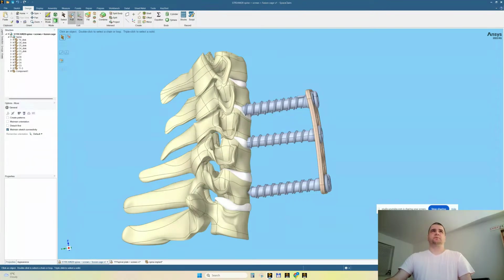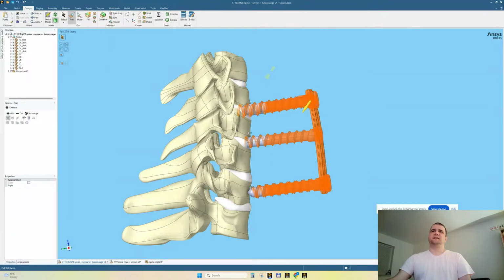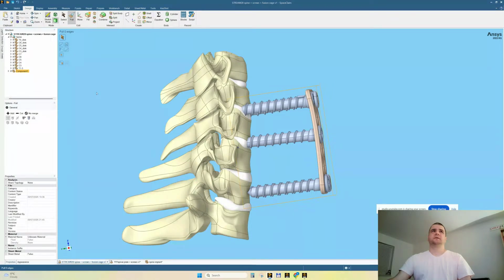So let's go here with Scale Body. We choose a point. We don't care exactly what point. And now it says select one or more bodies to scale. Let's drag from the right to the left, but it's selecting only surfaces. I would like to select bodies. So pick an anchor point. How do I select? No, it's not possible.